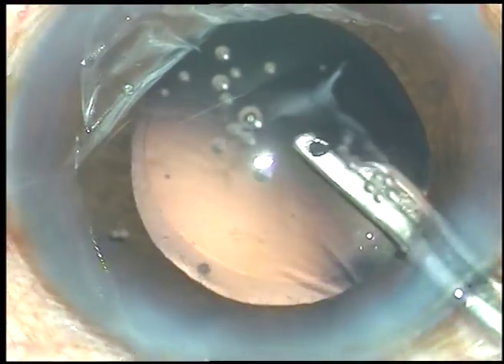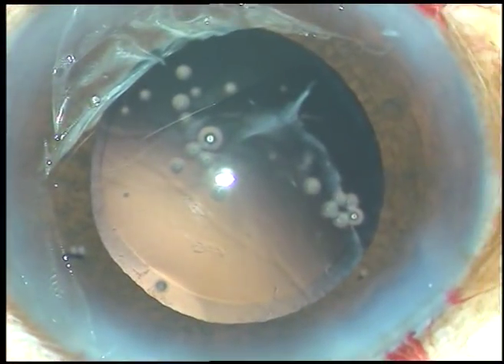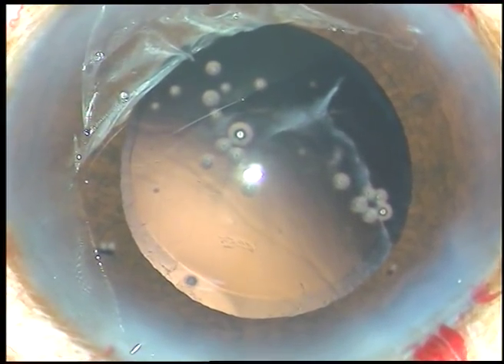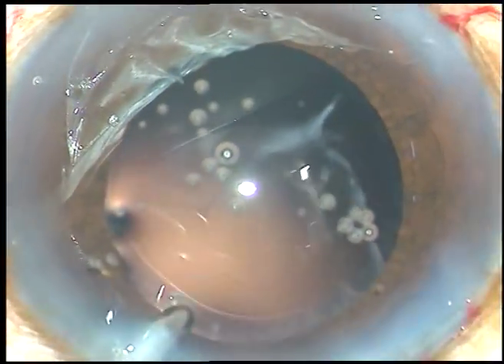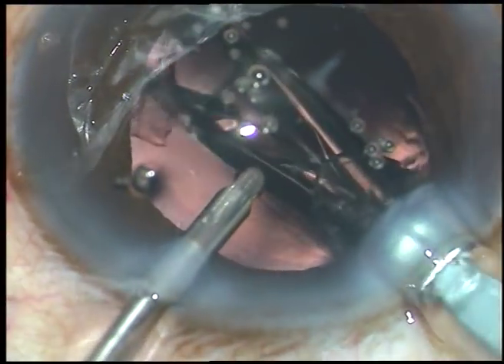That's it — the nucleus, epinucleus, and cortex are removed. And now, in this case, a hydrophobic acrylic intraocular lens is being implanted under irrigating fluid. This irrigation keeps the anterior chamber formed and the lens goes into the capsular bag.